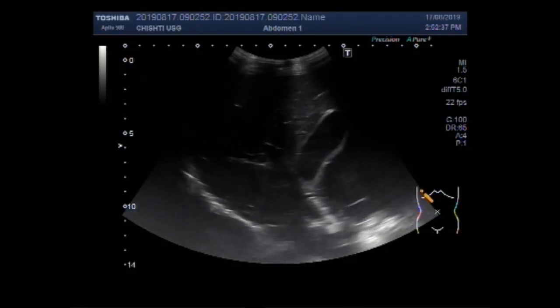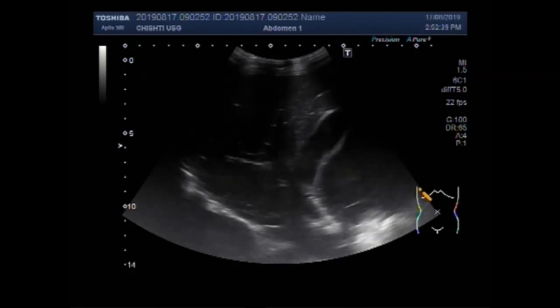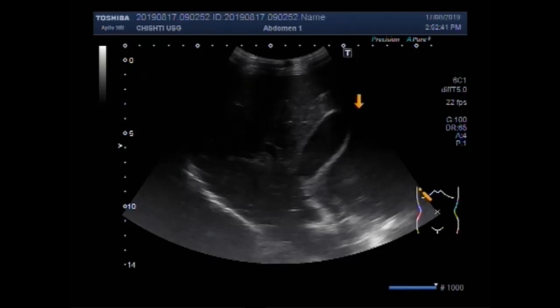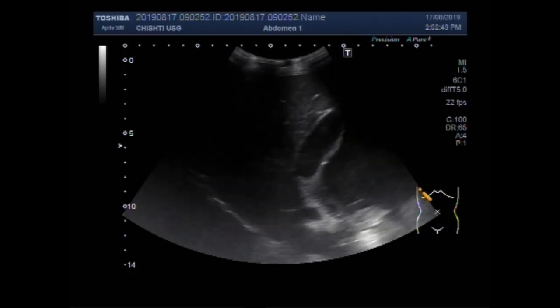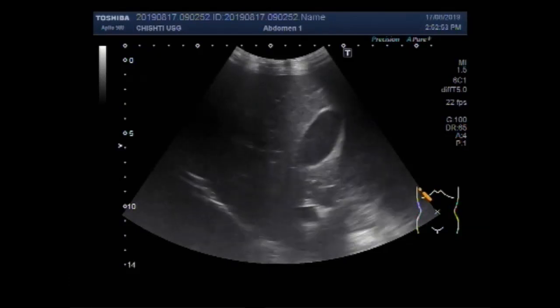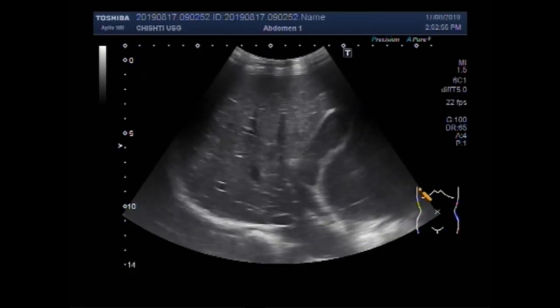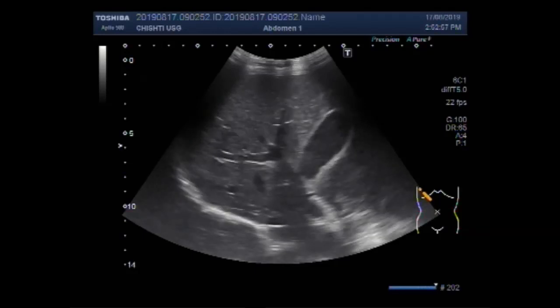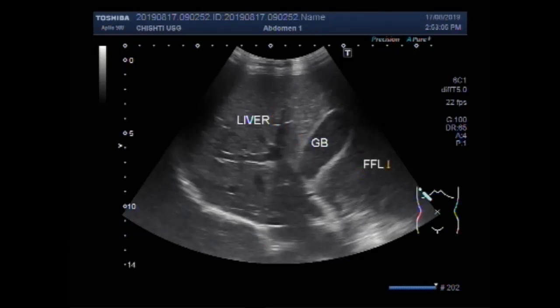This is the gallbladder and liver. You can see the blood is seen in the adjacent area of the gallbladder, and this is the free fluid.